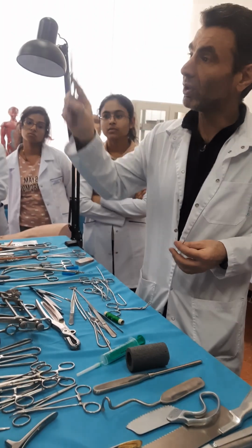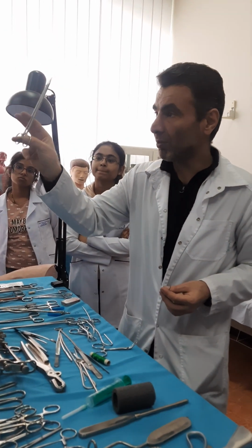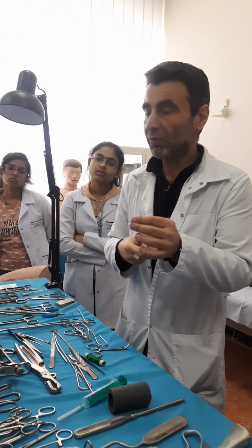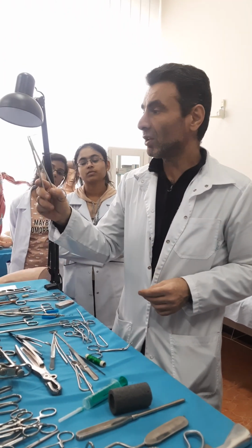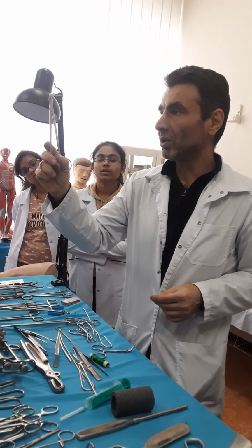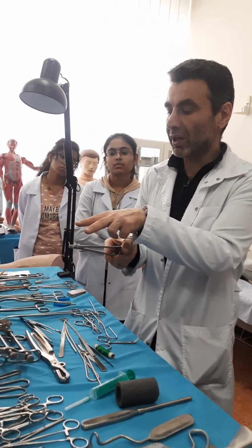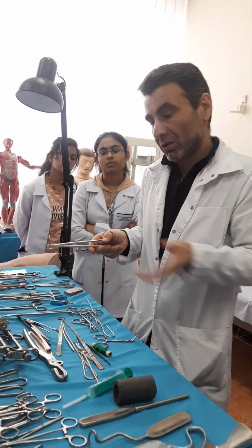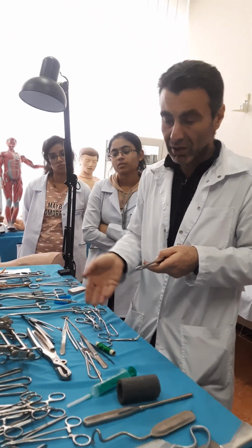The classical needle holder, we call it Hegar's needle holder. Like any other instrument with 2 apertures, with the first and fourth finger we push, we open, and we fix the needle. How do we make the fixation? Now look, the needle should be absolutely perpendicular to your needle holder. The needle should be split into 1/3 blunt, 2/3 sharp. Usually, if I'm right-handed, the needle looks to the left. If I were left-handed, the needle would look to the right, and the tip looks upwards.